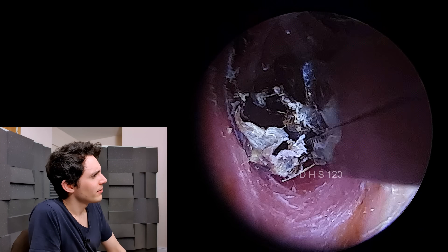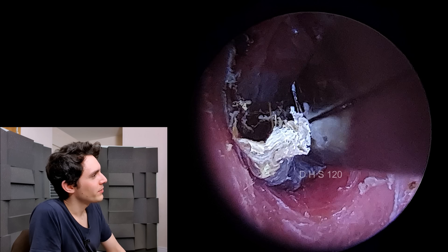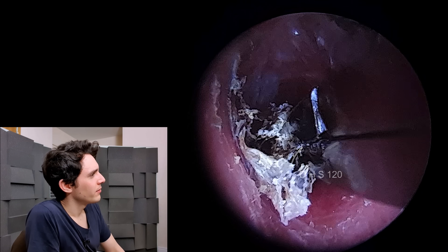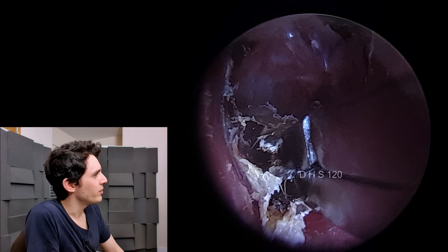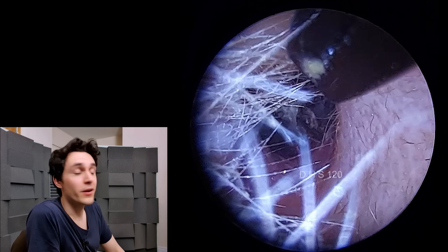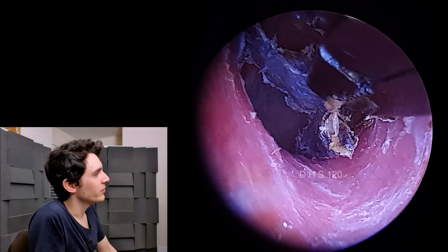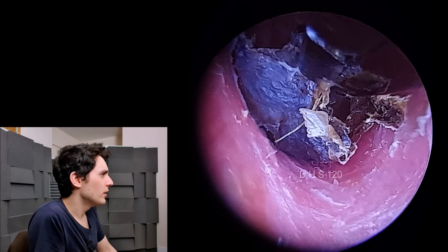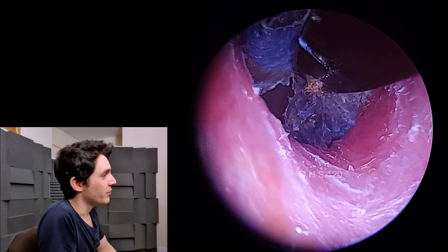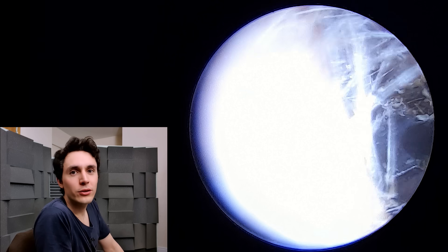Crocodile forceps again, just trying to grab onto this piece of debris — I think this was probably the fourth or fifth attempt. Total failure again, but you can see the fungus — that white furry stuff — near the jaws of the forceps. Believe it or not, these are the smallest crocodile forceps I could buy — micro jaw crocodile forceps — and yet they're still too large for the job. But right here I can get it. You can see I'm pulling on the skin, but it has come away thankfully without any trauma.